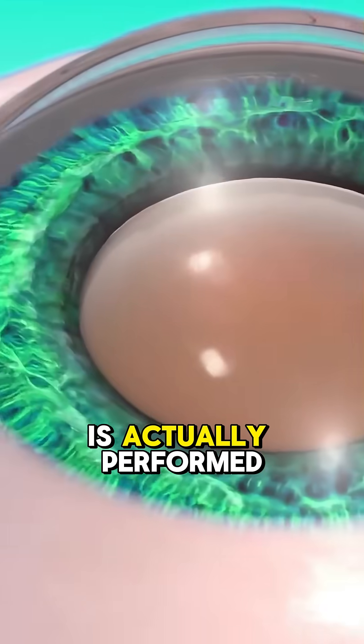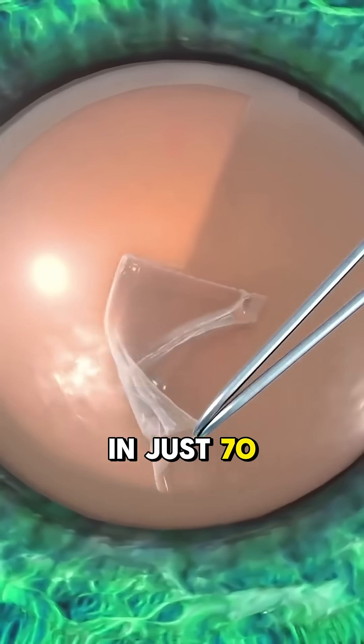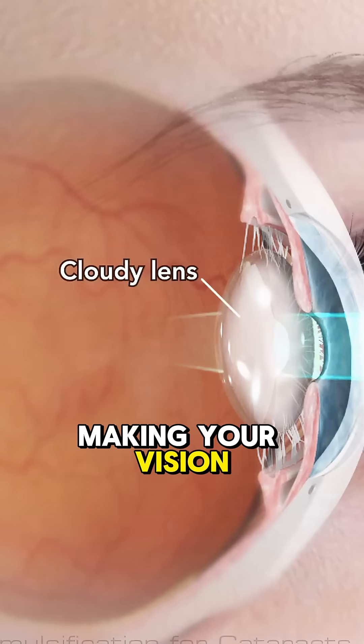Ever wondered how cataract surgery is actually performed? Let me walk you through it, step by step, in just 70 seconds. Cataracts form when the natural lens in your eye gets cloudy, making your vision blurry — kind of like looking through a foggy window.